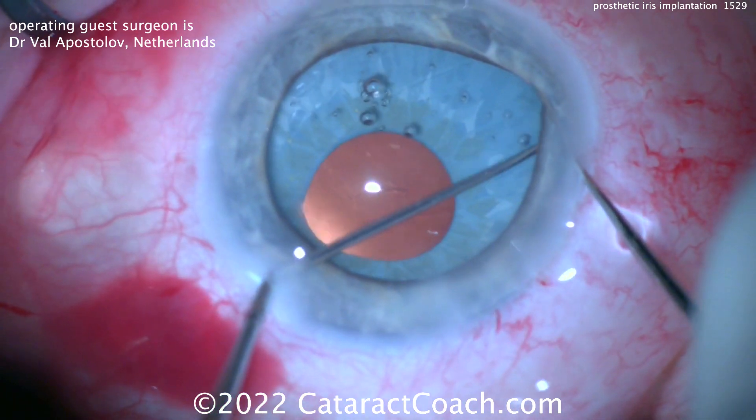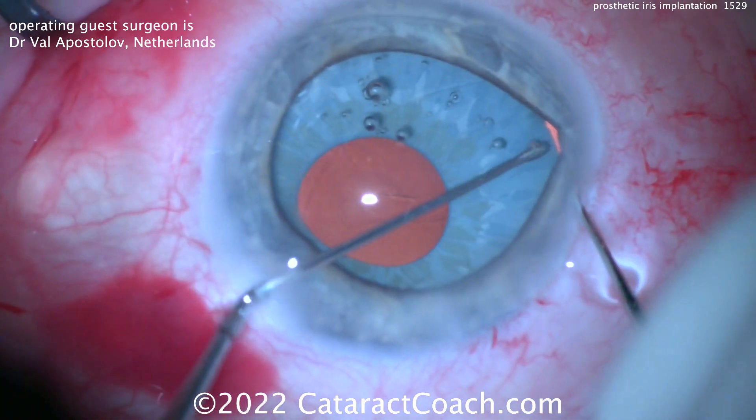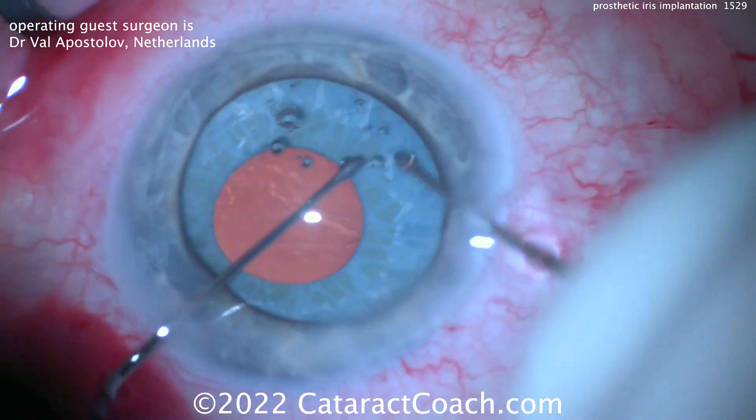The take-home lesson: a nice, big, juicy capsulorrhexis. I've not yet implanted one of these, but if I do in the future, I will be sure to make a 6.5mm rhexis just to facilitate things and make life a lot easier.